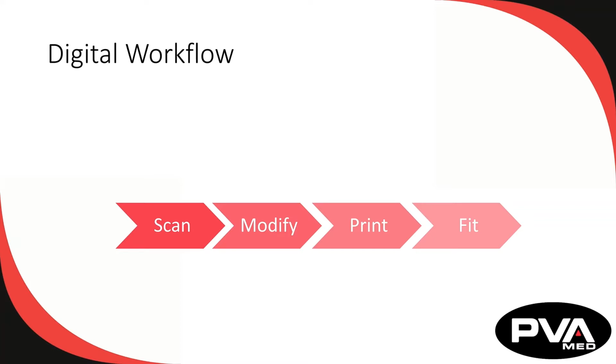The module is organized by workflow step, starting with the benefits, then an overview, followed by a demonstration using real-world hardware and software employed by clinics today to perform tasks within each step of the workflow.